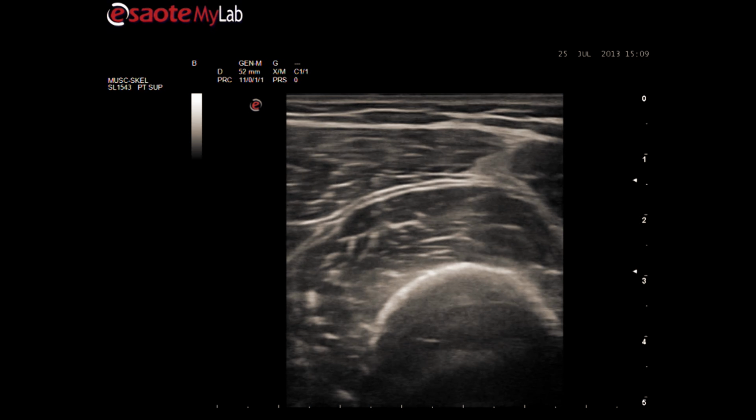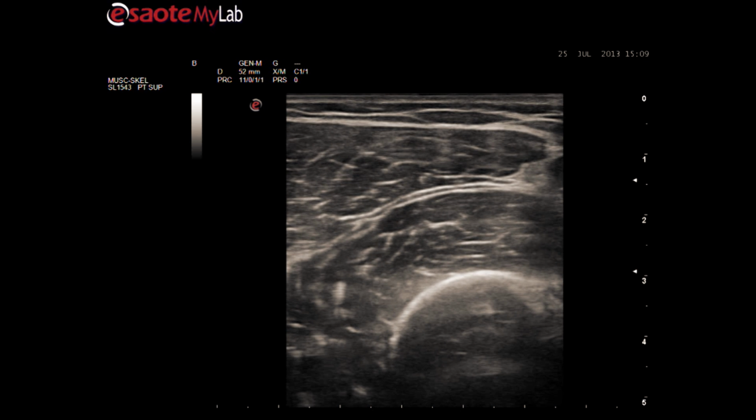Can you see the little white fibers inside the muscles? This is endomysium, connective tissue surrounding the little muscle fibers. We go back to the central upper leg to see the rectus femoris again. Now a small muscle. The underlying vastus intermedius is still quite big.